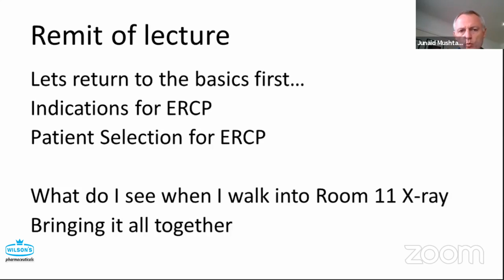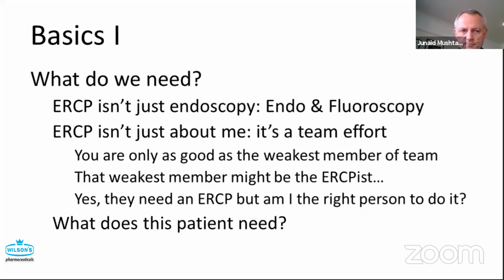So what about the basics first? Once we know the basics, it touches immediately on all of the indications and also the patient selection. So what do we need? ERCP isn't just about endoscopy.